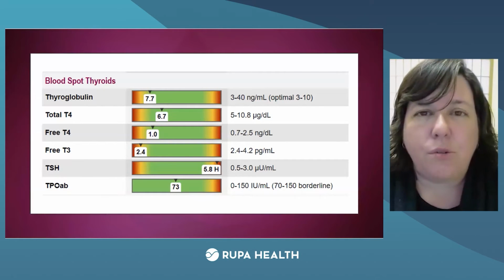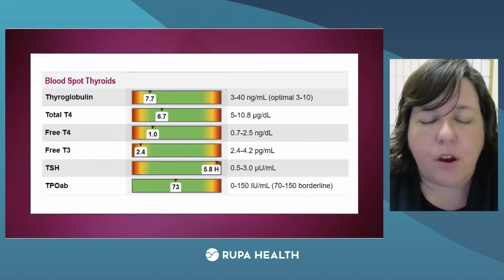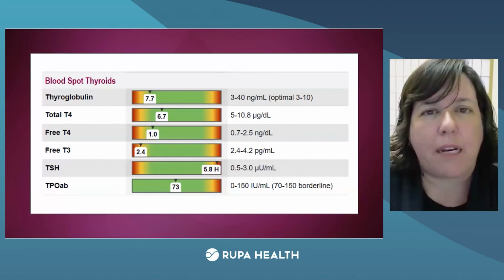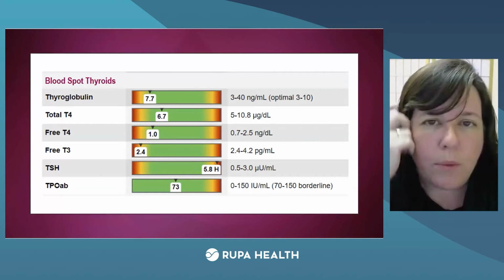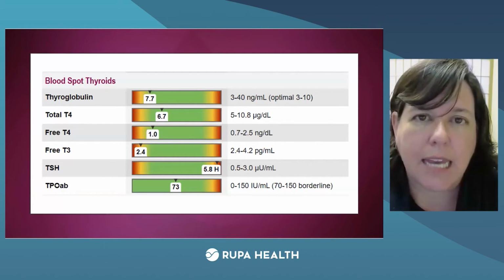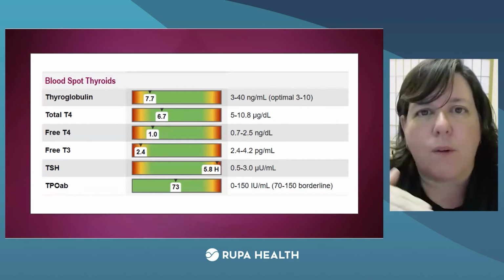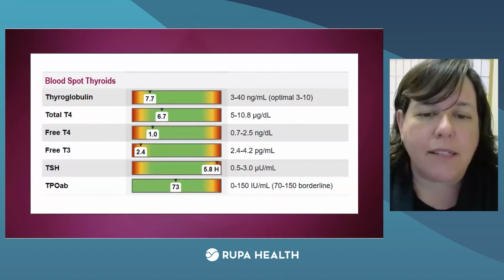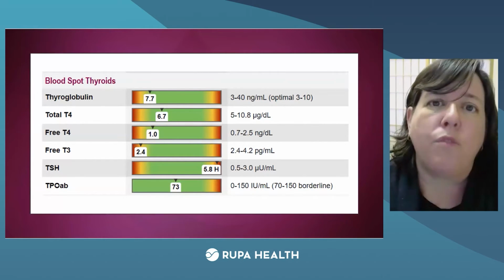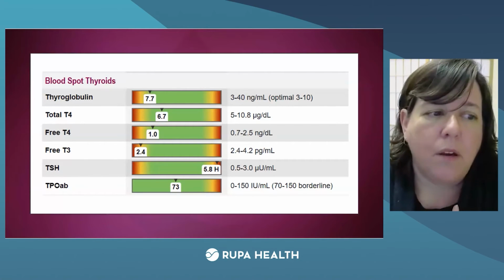And I do think one of the nice things with ours is that these antibodies are not just positive, negative, right? It's a spectrum. So normally they should have pretty low levels. They should be really like less than 10, but you'll see them gradually increase. A true positive is going to be 150. We've seen them in the thousands, right? But you'll see it as a rise over a spectrum of time with these.